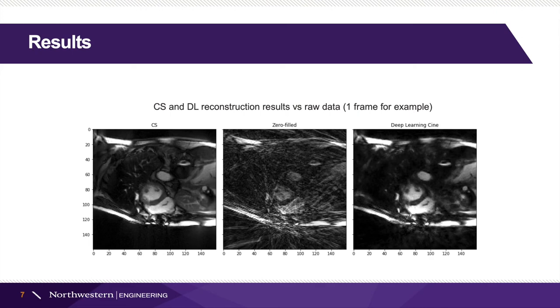As we can see, although the figure produced by deep learning is not as clear and accurate as the figure generated by compressed sensing, the deep learning does show improvement over the raw input figure and generates a relatively reliable shape of the heart.